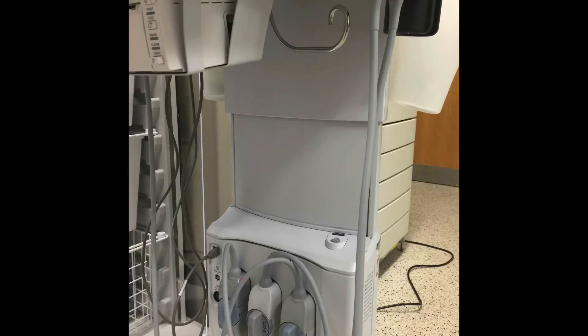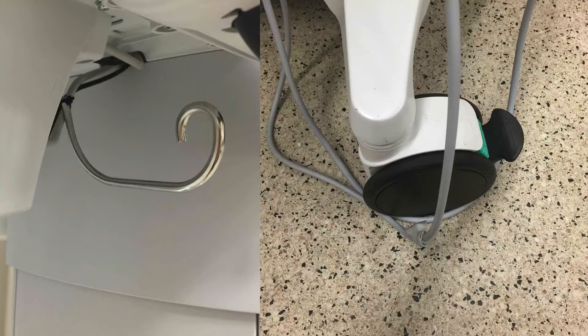On the system, make sure the cords for the ultrasound probes are in the cord keeper, which is that metal bar at the top. You can see the little curl at the end to prevent the cords from slipping out. If the cords are not in the keeper, they can actually reach the level of the wheel and be run over or fractured.